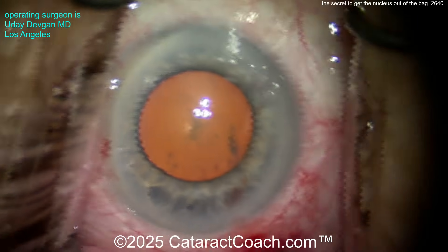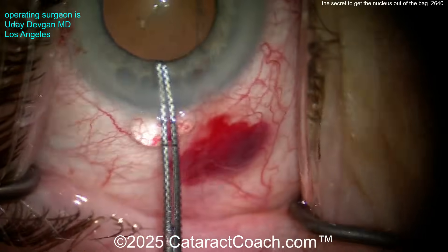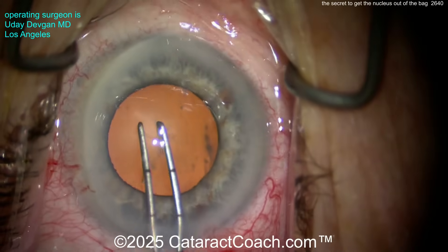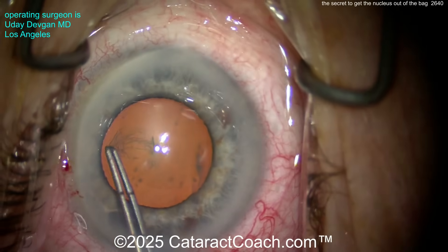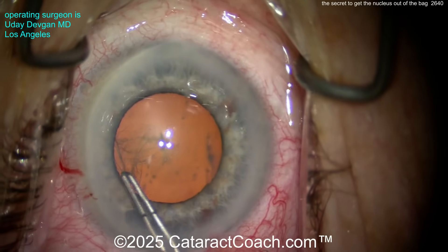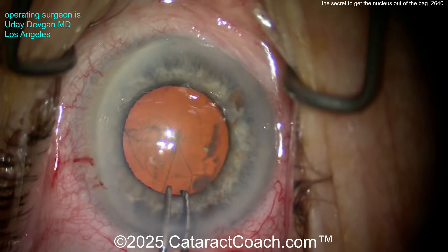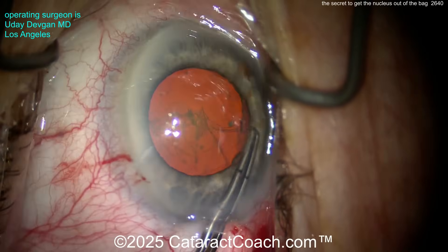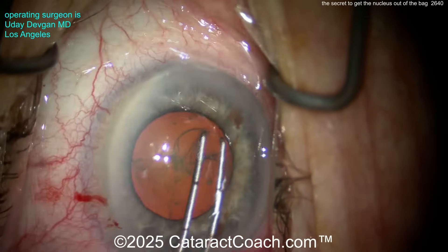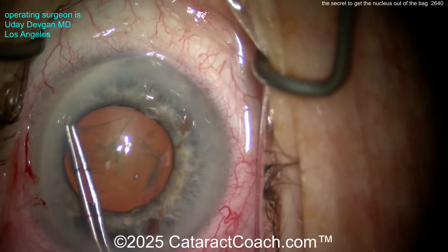Now going inside with the forceps. My forceps are marked off at two and a half and five millimeters on the tip so I can tell the rhexis size. Look at that — the pupil is just about five, five and a half. So I want to make this rhexis right up against that pupil margin. The first step in getting this prolapsed lens out of the bag is you've got to have the right size rhexis. Five and a half is your goal. Do not make a baby rhexis — no baby rhexis.